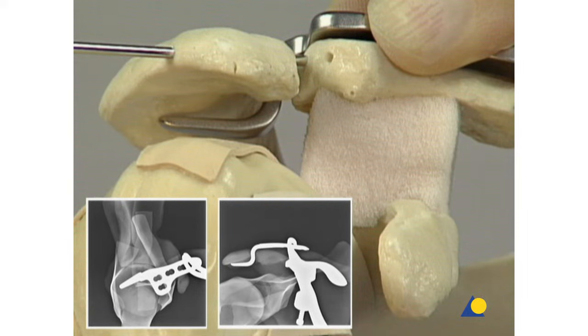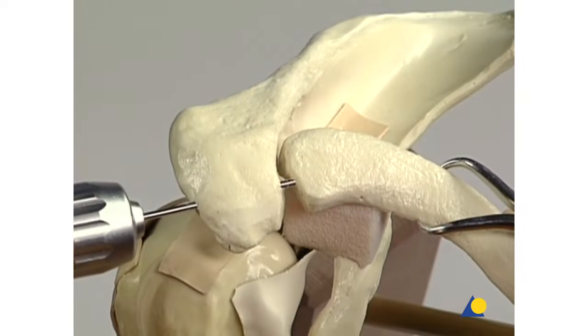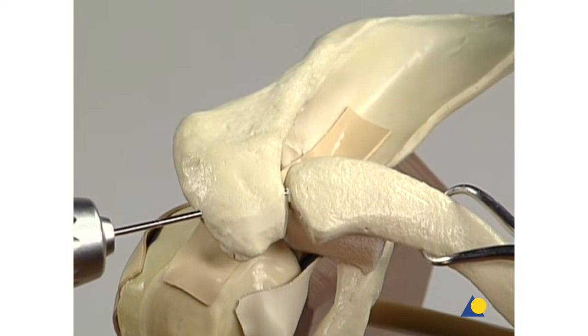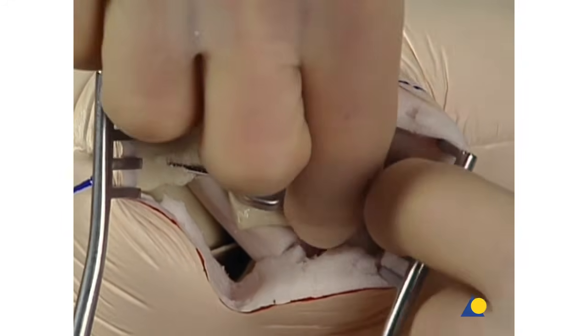If the radiological control shows that the hook is not in full contact with the entire length of the underside of the acromion, then either the posterior position of the hook or the posterior reduction of the clavicle must be corrected. Correct alignment is achieved by positioning the plate at the posterior lateral end of the distal clavicle and not at the clavicular shaft. This adjustment ensures the correct anterior position of the hook and guarantees that the hook will not be pointed in the direction of the spina scapulae. The trial implant should never be bent or implanted. Once the hook size has been determined, the trial implant is removed and the selected implant is positioned.